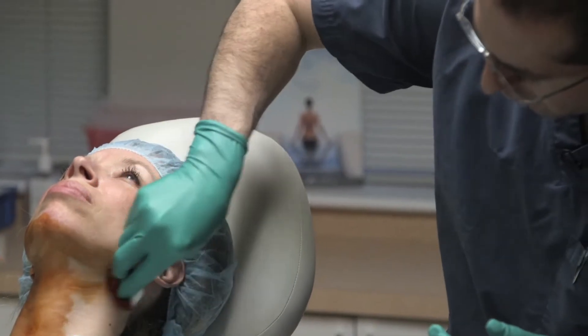Prior to performing the thermitite procedure, we prepped the patient's lower face and neck with a betadine solution.